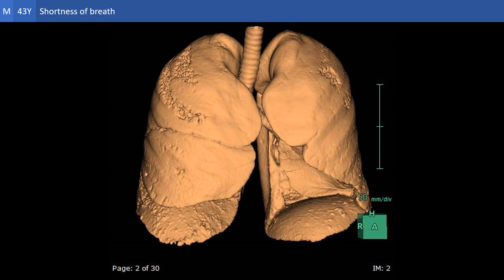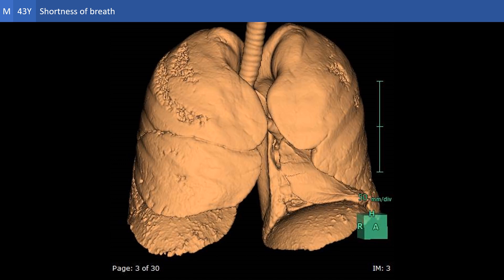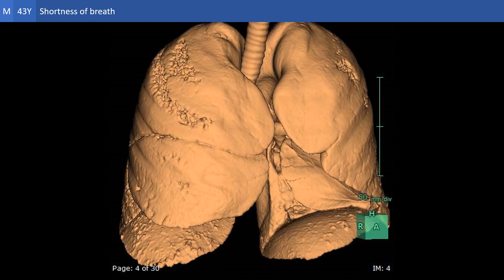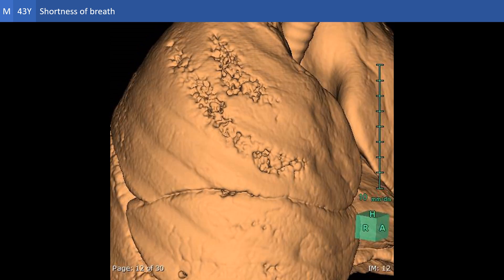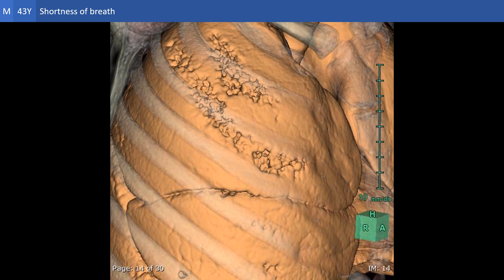The parallel band sign is a recently recognized sign for the diagnosis of scleroderma, and with rotation of the lungs on these volume-rendered images of the lung surface, we can see the sign to a better advantage. I am adding here the bony thoracic cage on the lung surface to show that the bands neither coincide with the ribs nor with the intercostal spaces.